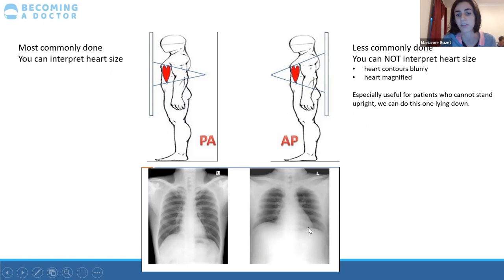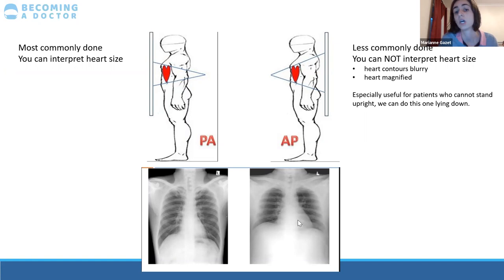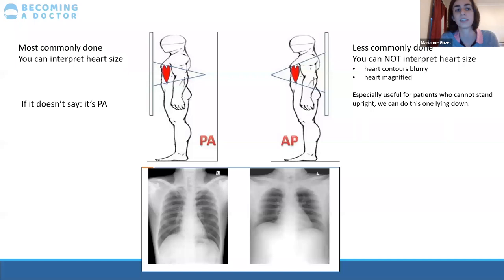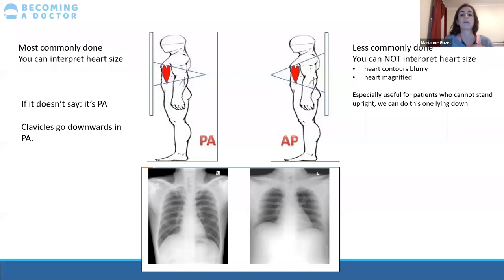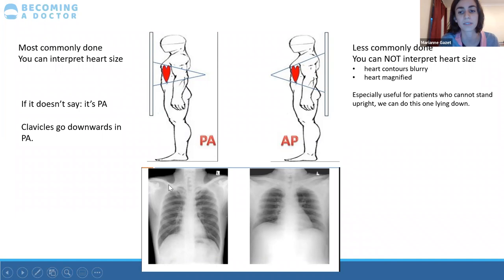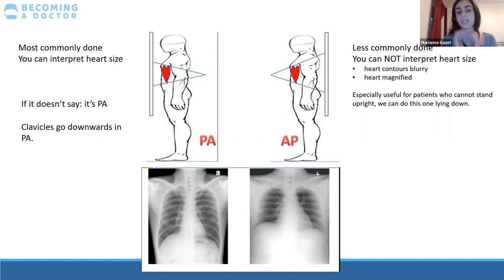The AP chest X-ray is not as good for seeing heart size — the heart looks very blurry and appears enlarged even though it's not; it's just an effect of the resolution. However, you can still see the lungs perfectly, so if there's a chest infection, you can see it. If it doesn't say on the chest X-ray, it's probably PA because it's the most common. An important check: on a PA chest X-ray, the clavicles will appear to go downwards, because the patient is asked to lift their arms up.